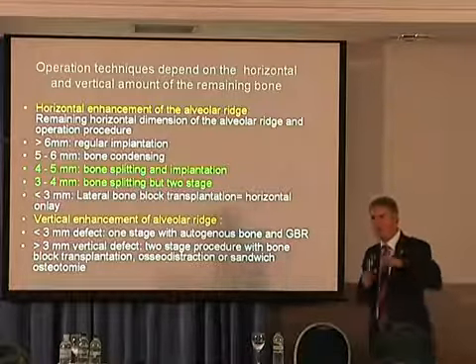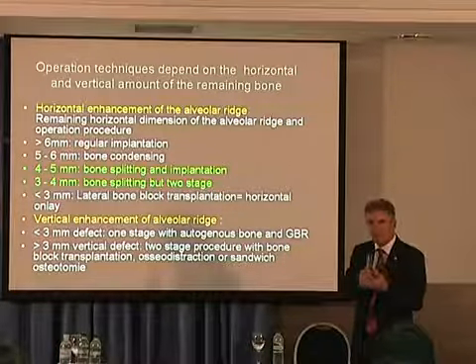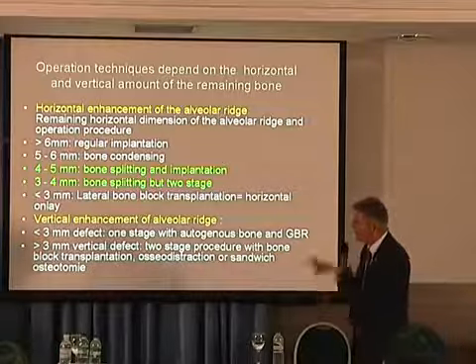In case of really advanced surgeons, 3 to 4 mm the same, splitting and implantation. On the more safe side, 2-stage, splitting, augmentation, wait 4 months, implantation.